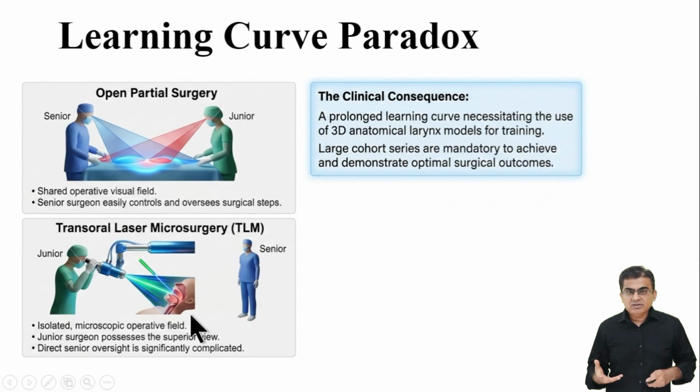This specific paradox makes the learning curve for laser surgery notoriously long and steep. It requires extensive dedicated training. And this is a major reason why this excellent surgery is not widely available in every hospital.